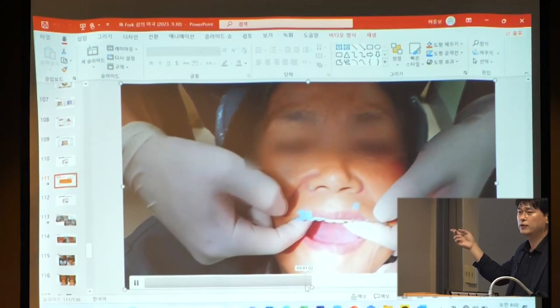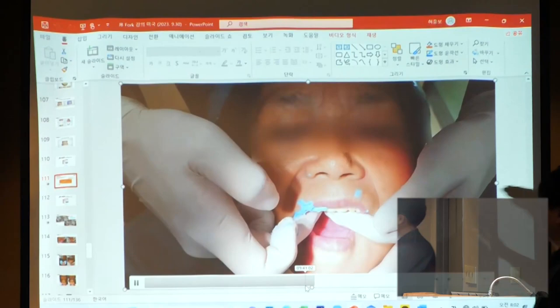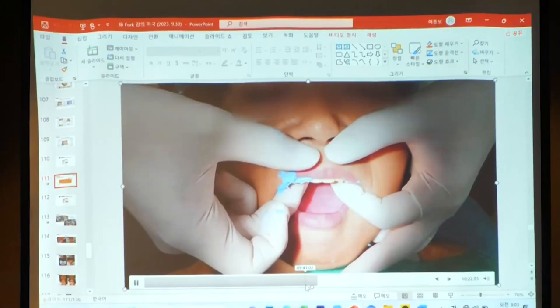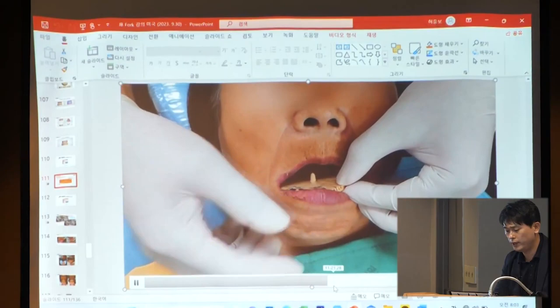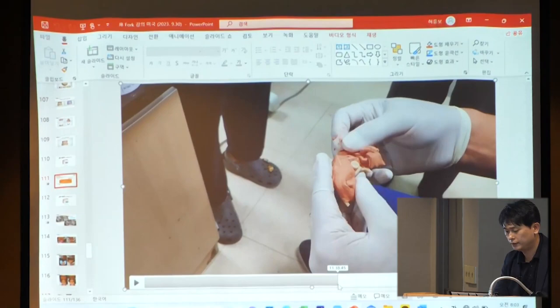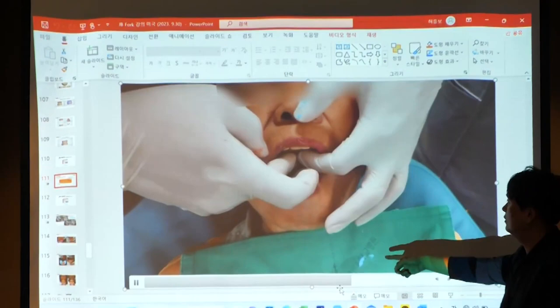At this time, on the same day as the final impression, you know, lip support. And this part positioned the silicone material. After you push this part, you can adjust the lip support directly. Okay, and then this patient also has remaining teeth. So I removed this part and positioned the lower plate like this. Applied the adhesive, and the body, and silicone, and then put the lower plate. This is upper, and this is lower plate, completed.